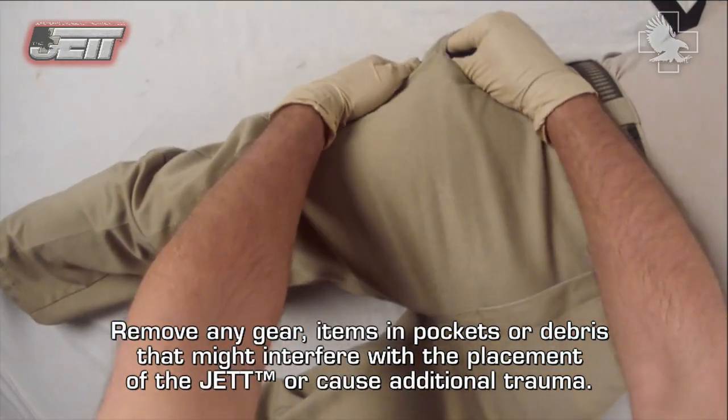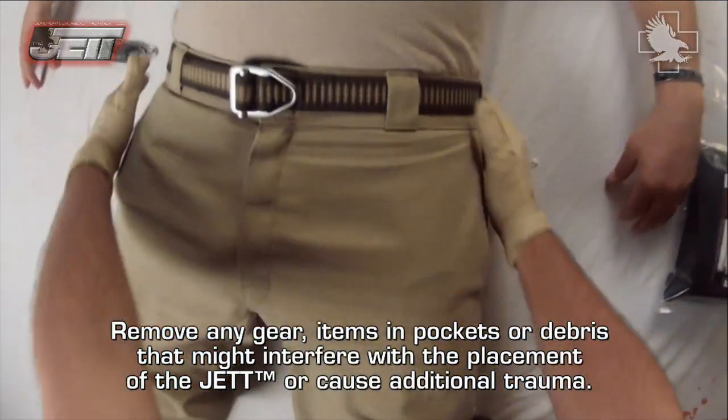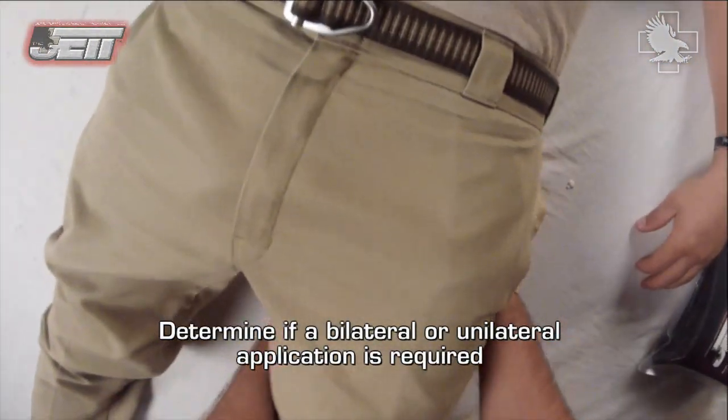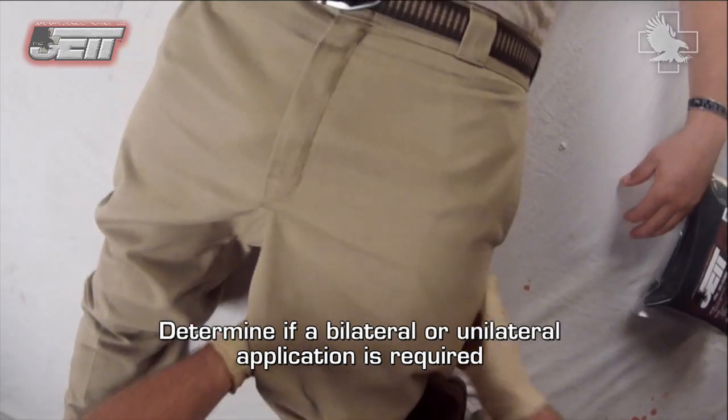Remove any gear, items in pockets, or debris that might interfere with the placement of the JET or cause additional trauma. Determine if a bilateral or unilateral application is required.